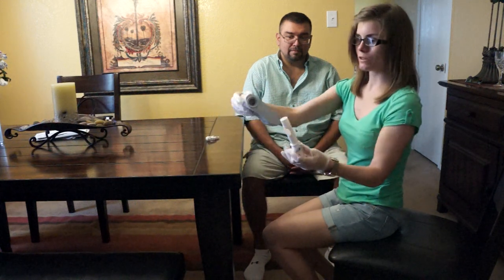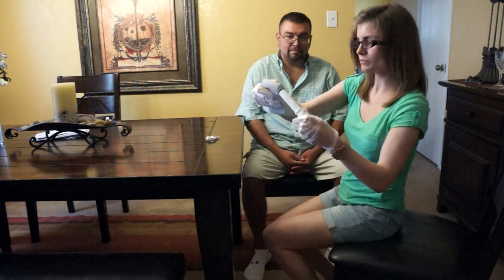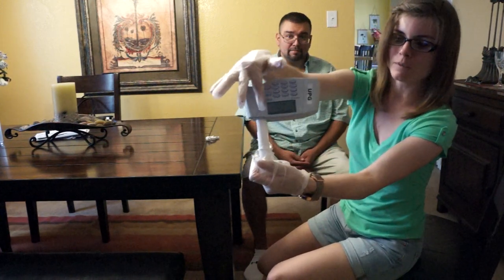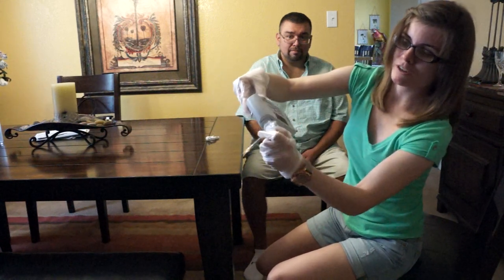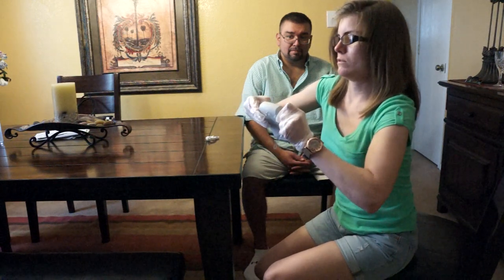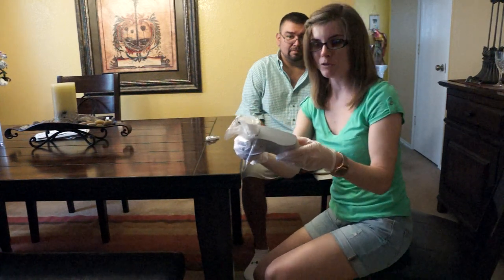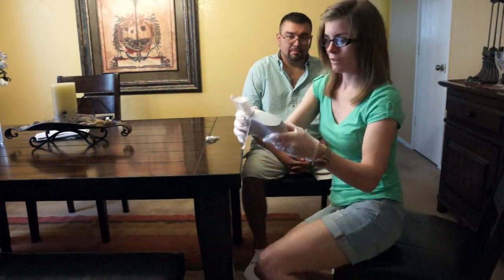Then you're going to stick the spirette inside the Easy One spirometer like so. If you see right here, there's a triangle at the top and a triangle right here. You're going to match them together and push it in nice and firm. Now go ahead and leave the packaging on the top part because, again, that is their mouthpiece, and you don't want to have to take that off until they're ready.